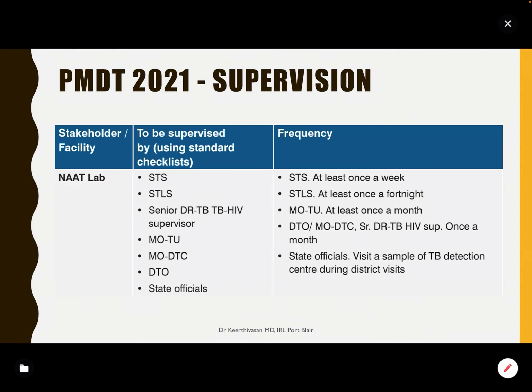Now, whenever there's a lab component, most of us think that it is mainly the LT or the microbiologist or the laboratory supervisor who is involved. But lab is a very integral part of our TB program. It impacts the treatment initiation, and also if there is any treatment modification to be done during treatment, all these are affected by lab results. So it is very important that all the stakeholders participate in this particular activity of supervision in NAT site.